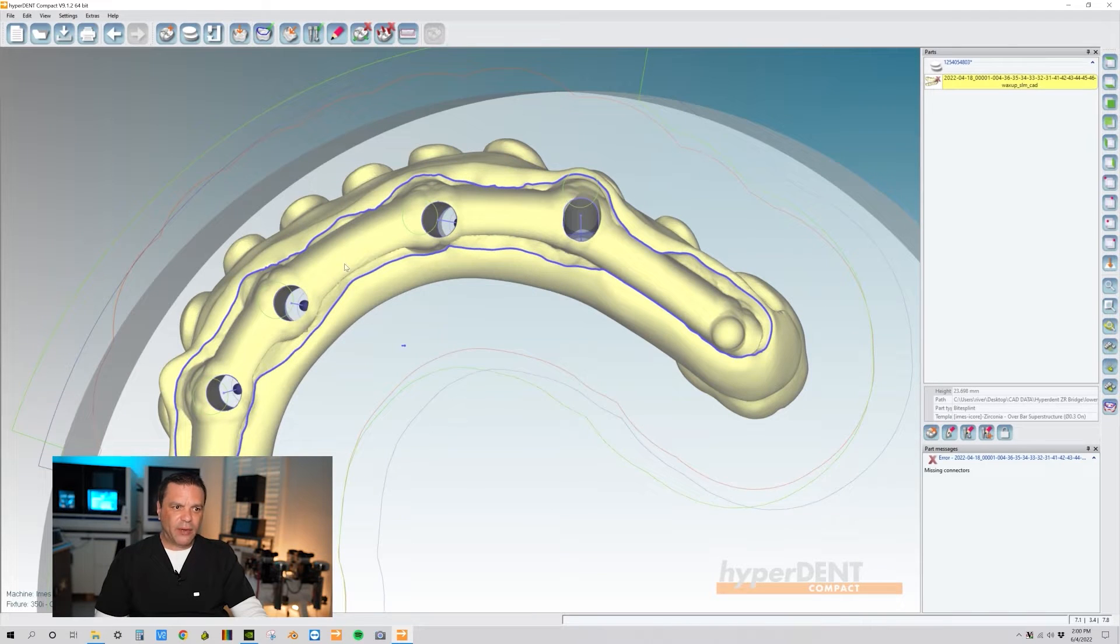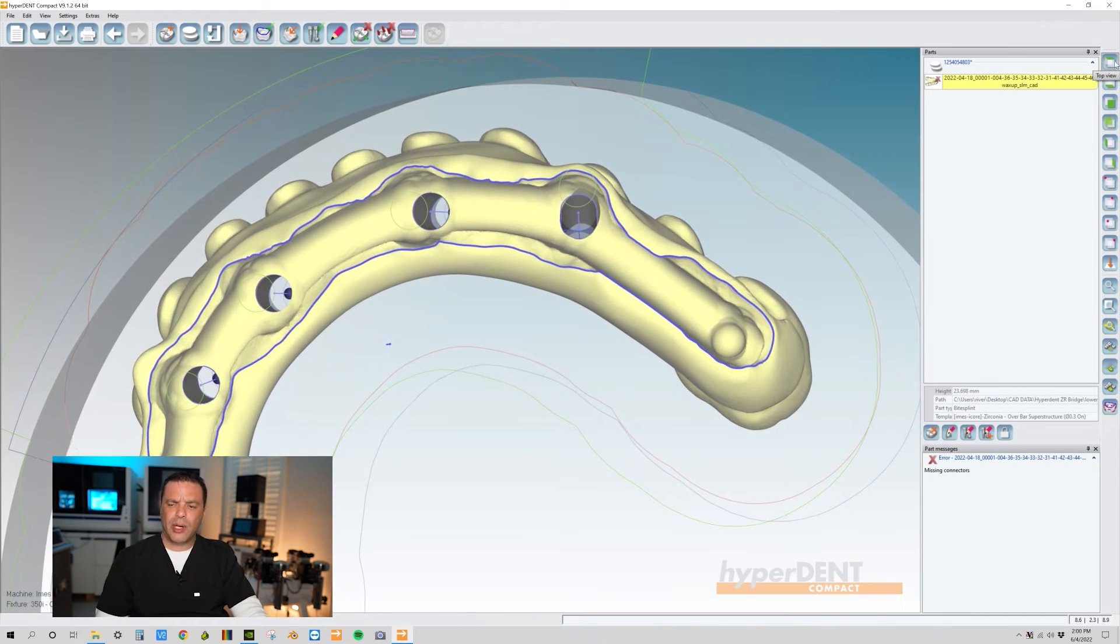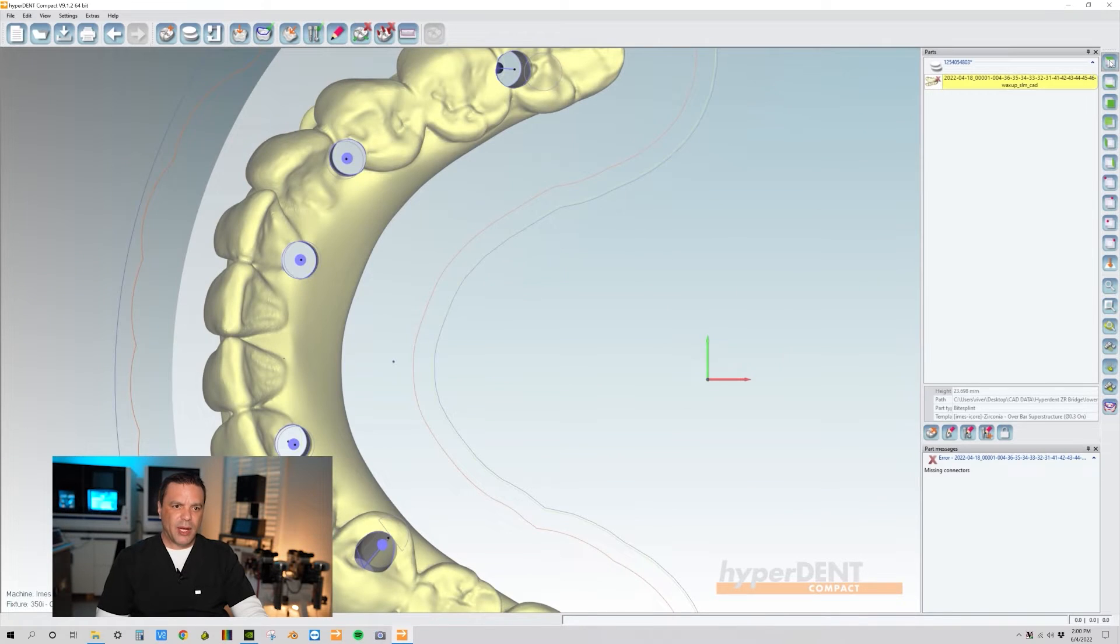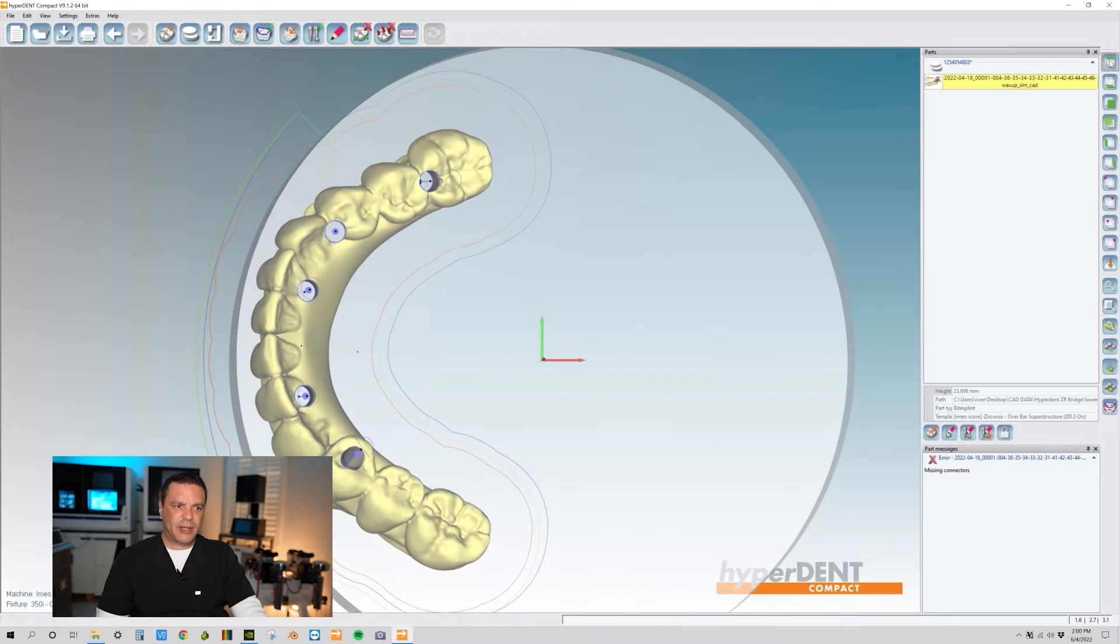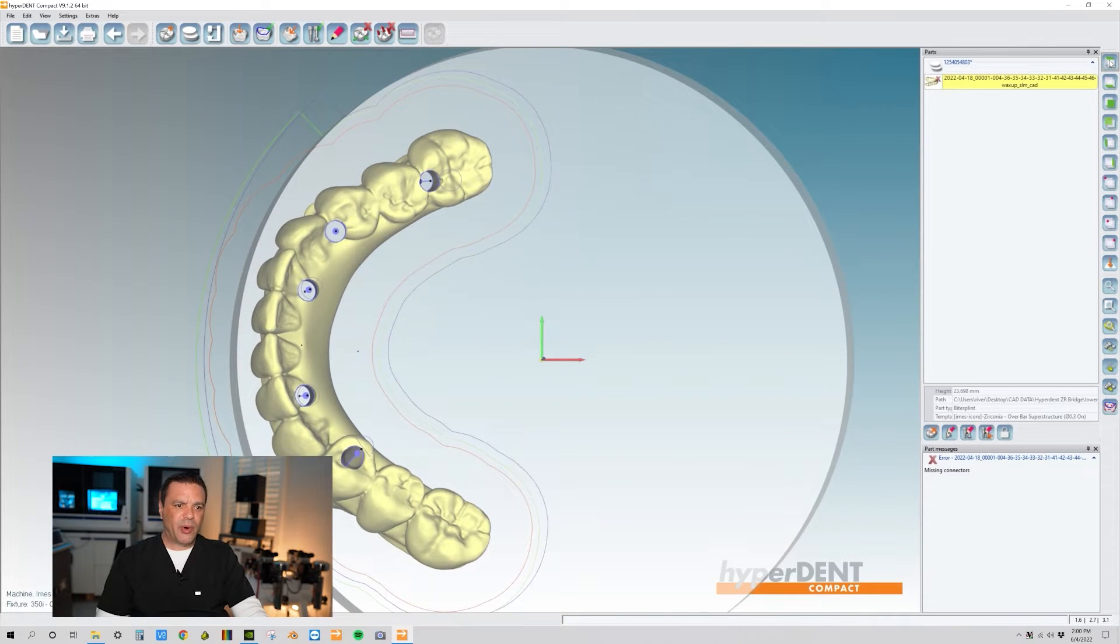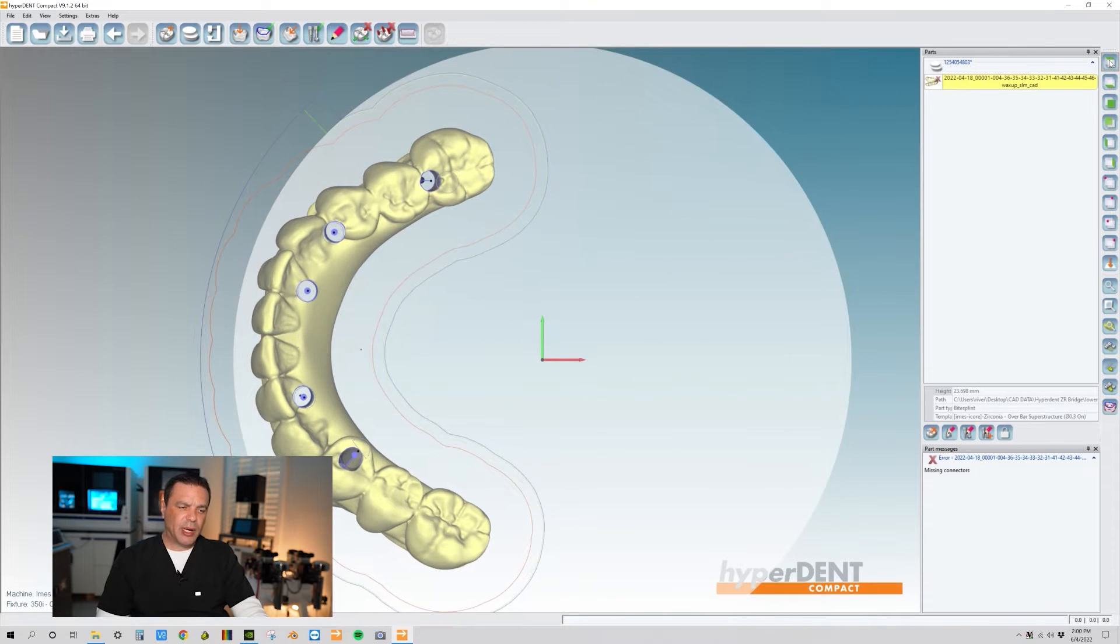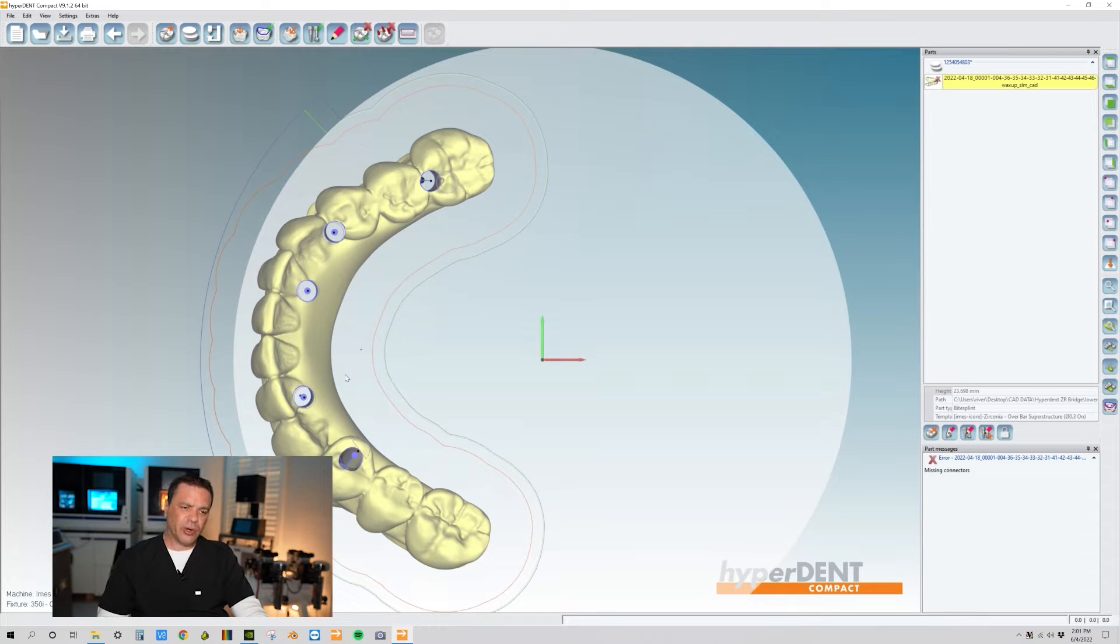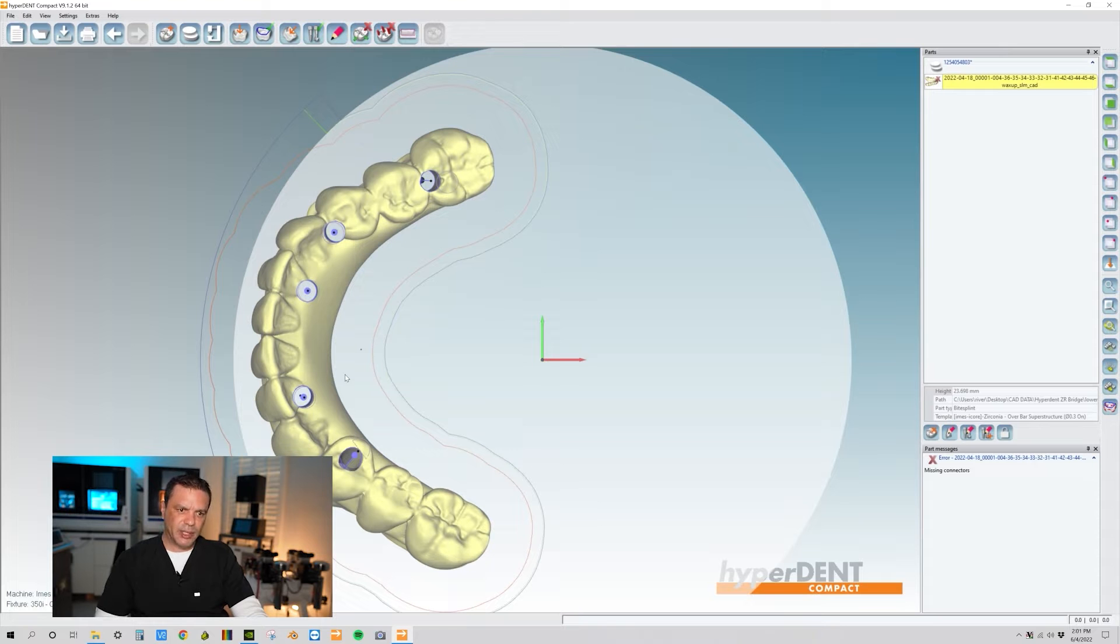All right, so now we have all the access holes marked out. What I like to do is come over here to the top view and make sure that the milling direction of the screw access holes is all going in the same direction and the diameter of the holes are correct, especially for the angulated screw access holes.